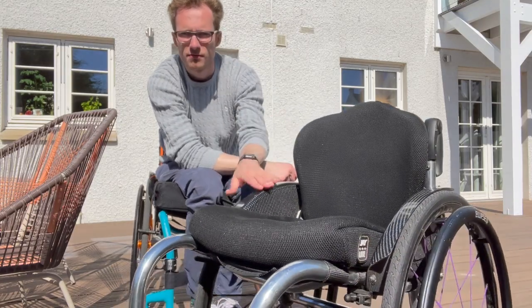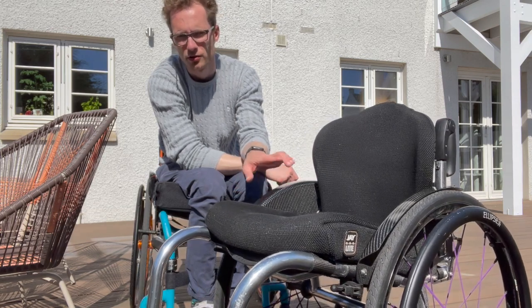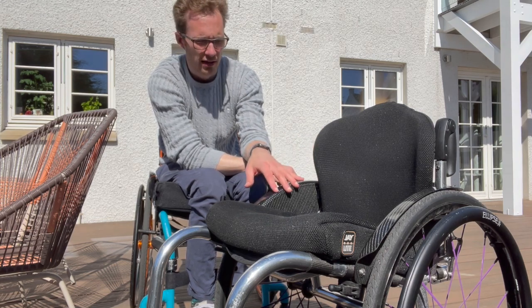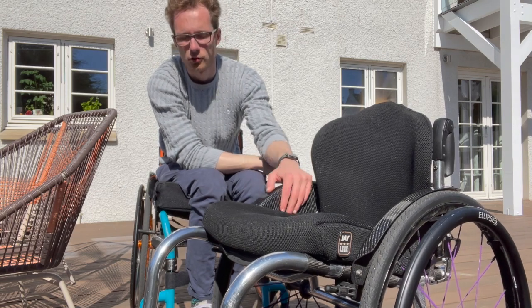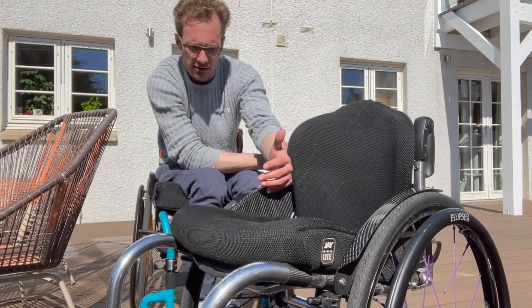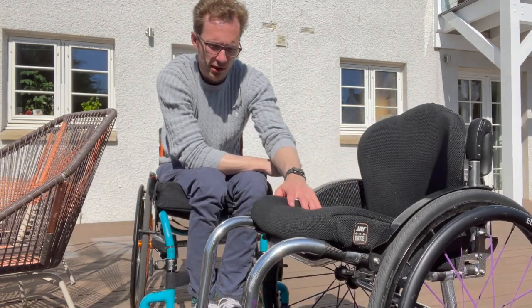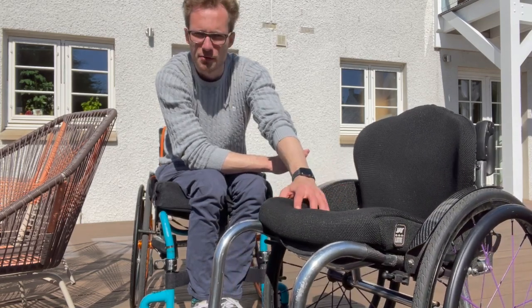Coming down the side, the fenders are a customizable option — I chose to have carbon fiber side guards. You can choose to have ones that fold inwards but I didn't really see the point of that, so I wanted them fixed onto the actual body of the chair. I think they look quite nice and they're tucked in and house the wheels really nicely as well.